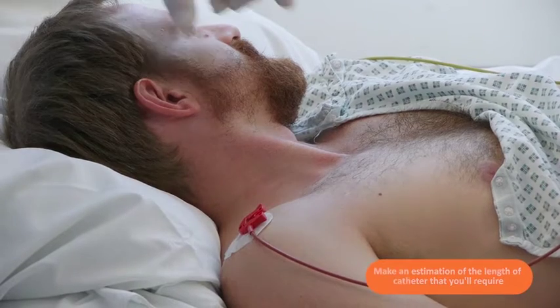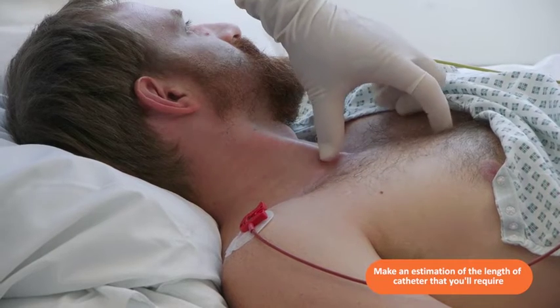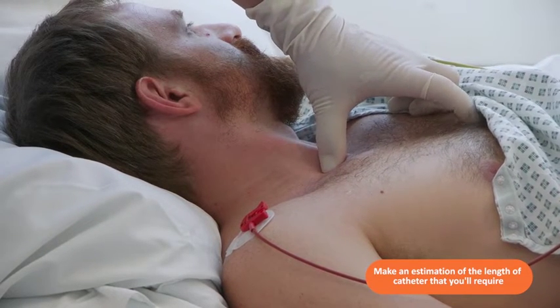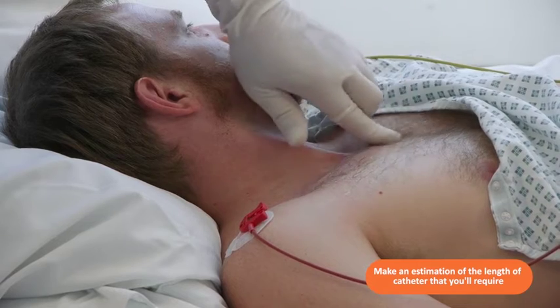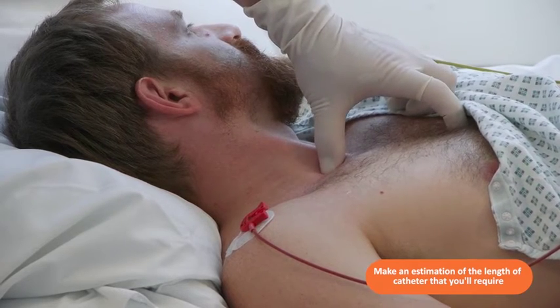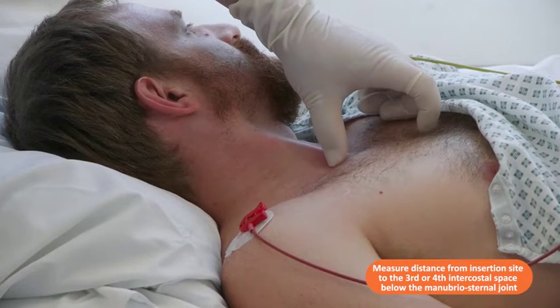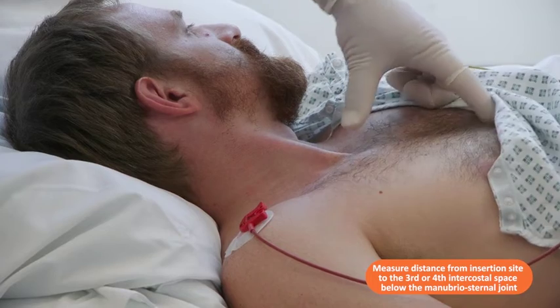Once we've made a vein assessment using the ultrasound and we have an idea of where we're going to insert the line, in this instance I'll probably be going around here, it's worth making a rough estimation of the distance that you're going to need, to inform you as to what sort of length of catheter you might need. We normally measure down towards the manubriosternal joint and add a couple of centimeters on, and we can see that that's quite a short distance.